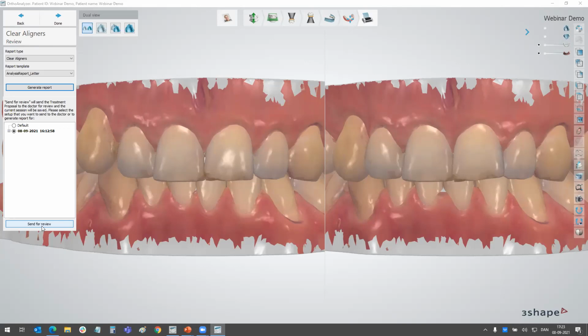Is there a vent hole in the hollowing models? No, not so far. It's something we will consider adding in a future version, likely the next major, but so far there's no venting hole. We see many of the printers have perforated build plates, and if nothing else, when you take them off, the resin will come out. But it's something that we will likely consider adding in the next main version.